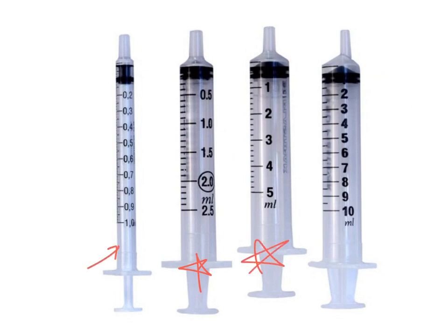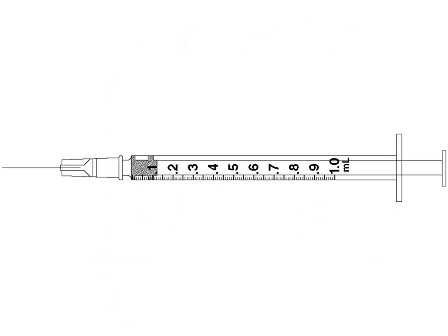Your 1 milliliter syringe we were looking at on the previous screen, this one, except this one was whole numbers compared to our picture of one like that. Yeah, this one right here. So this gives you a clearer view of that 1 milliliter syringe. You can see it goes all the way to just 1 full milliliter, so it's listed there as 1.0, not to be confused with 10. When the decimal's there between the 1 and the 0, we know that that's 1.